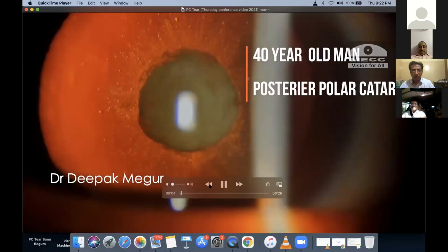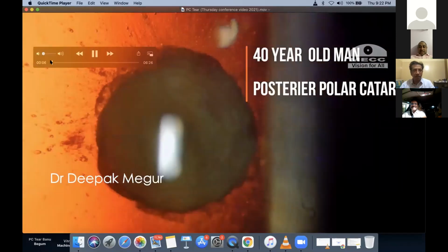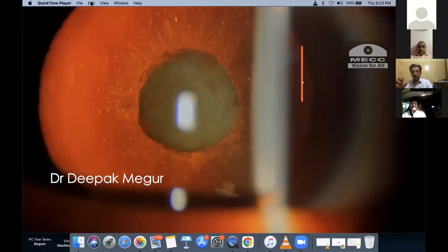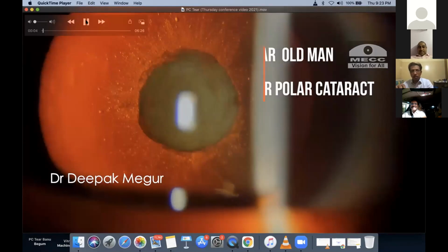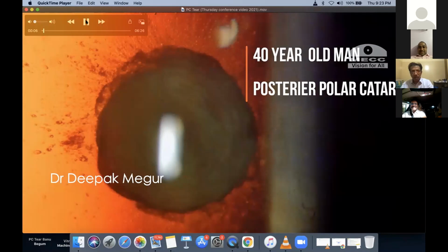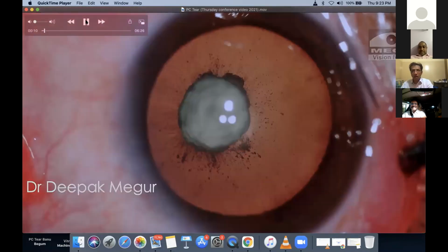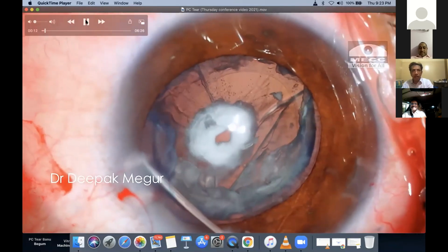Okay, I'll be sharing my presentation. The question is: is it possible for us to prevent vitreous from prolapsing in the event of a PC tear? That is the idea which I'd like to present here. This is a young male, classical posterior polar cataract, and the nucleus has been managed. I'll begin from this stage.